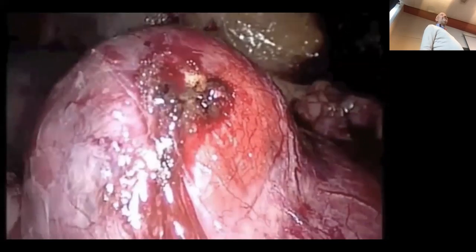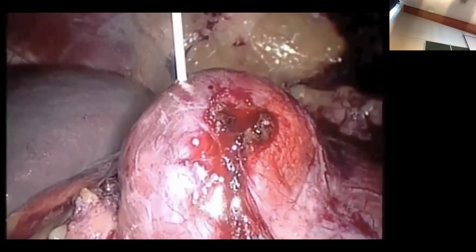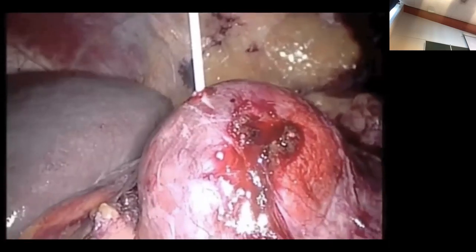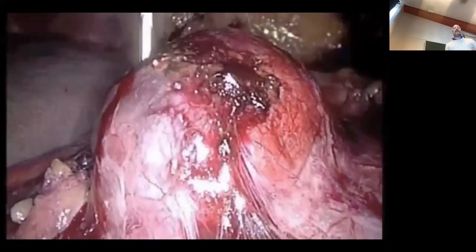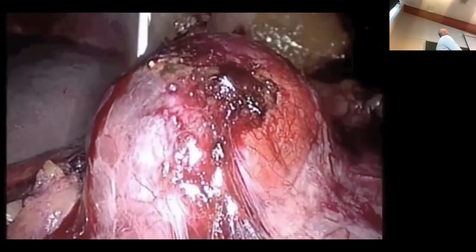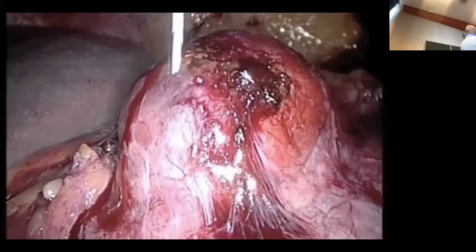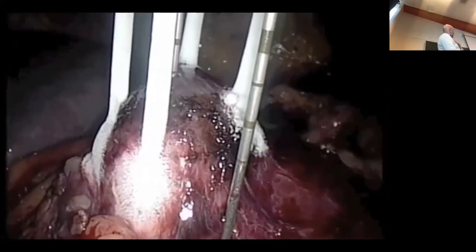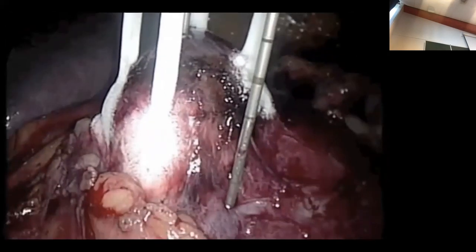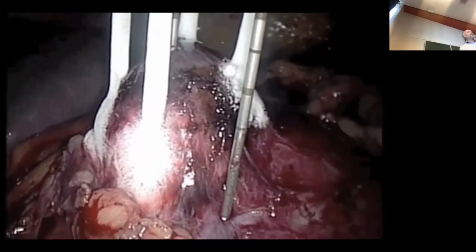You want to see an example of that? This is with the cryoprobe. What you see here is a kidney tumor where we bring in a needle. In this case, it needs to be positioned a little bit extra with an extra tool, but you really bring it into that growth. When you're done, you can have 5 of these needles and start freezing a tumor. You see some temperature probes there in the middle, the gray ones. We monitor the temperature.